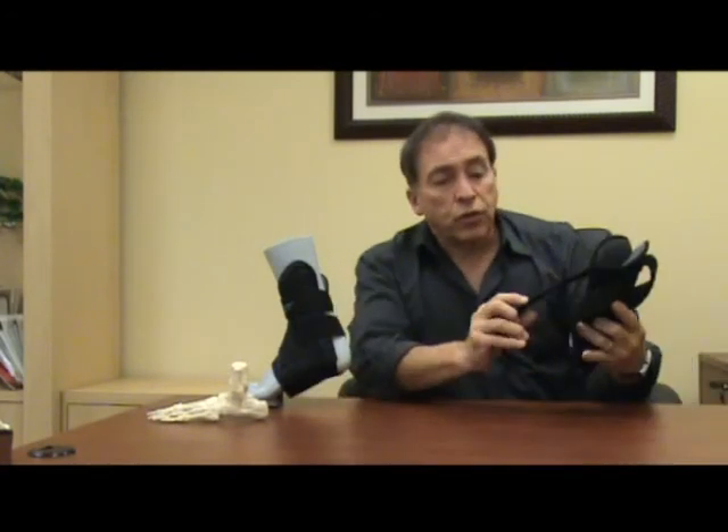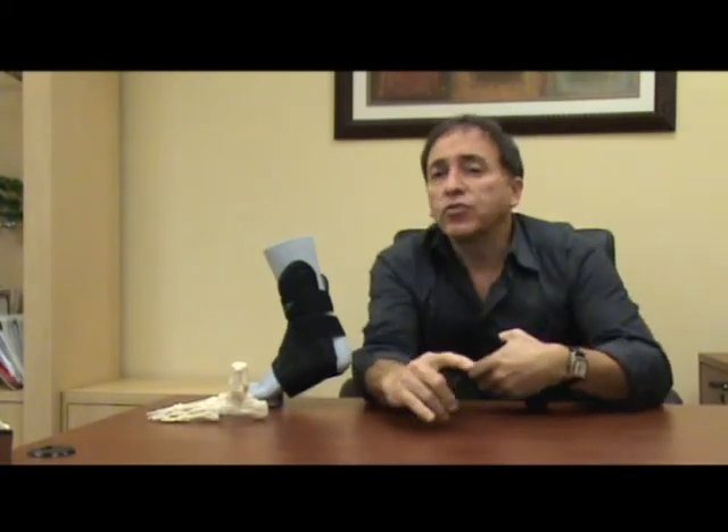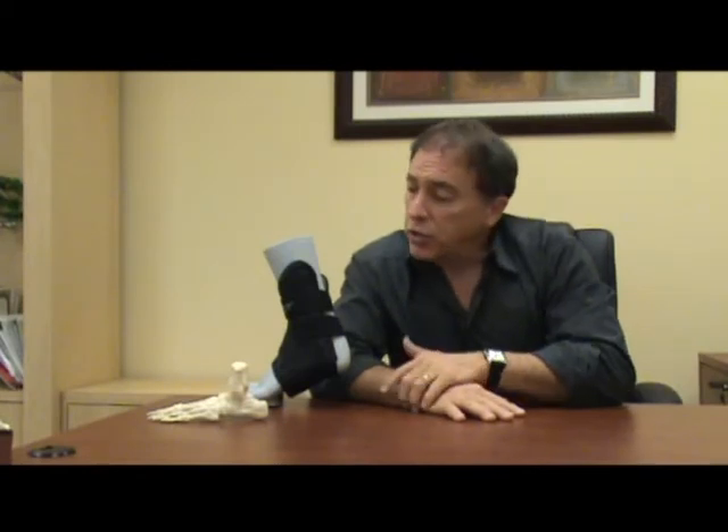Another unique feature of the brace is the ATF strap. This ATF strap makes reference to the anterior talofibular ligament of the ankle, which is the ligament that most people stretch or tear when they sprain their ankle. When you pull on this ATF strap, it supports and stabilizes the outside or the lateral aspect of the ankle. The more you tighten the strap, the more support the brace provides.